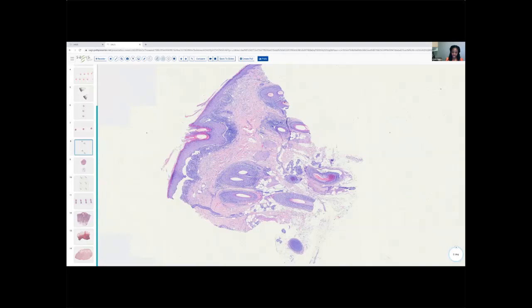And so all those other factors, you know, we certainly want to keep them in mind. I'm seeing catagen, telogen shift. Yes, we are seeing some, but we have a robust inflammation, so that can certainly happen. You know, miniaturization, etc. But the main point is we have this pattern that is just absolutely diagnostic. So this is an example of Lichen planopilaris.